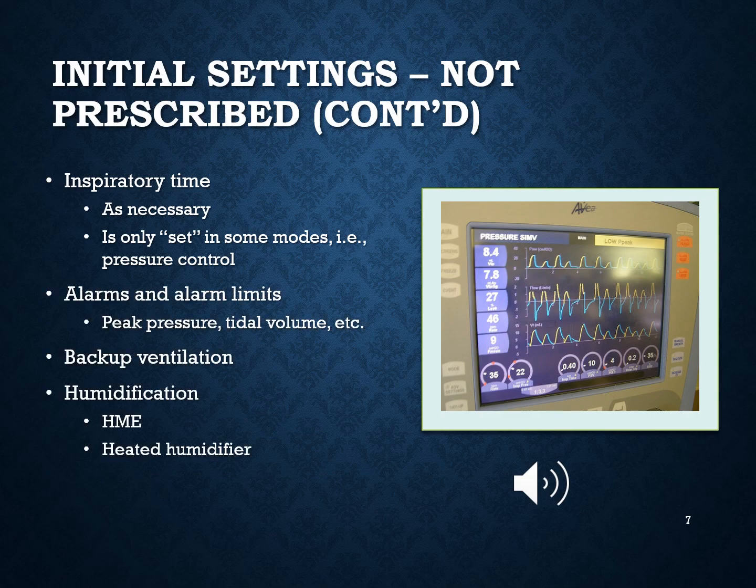Other settings that are not going to be prescribed for you include the I time. Now you're going to adjust this as necessary. Know that the I time is not available in all modes. This is available in the pressure control mode of ventilation. So you're going to adjust the I time in that mode as necessary.